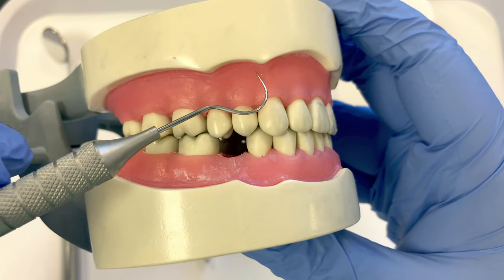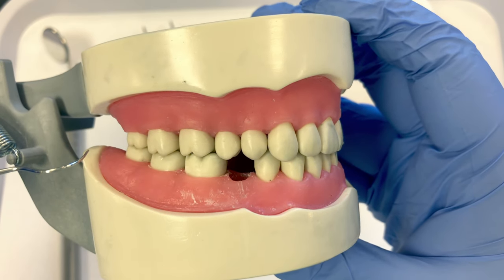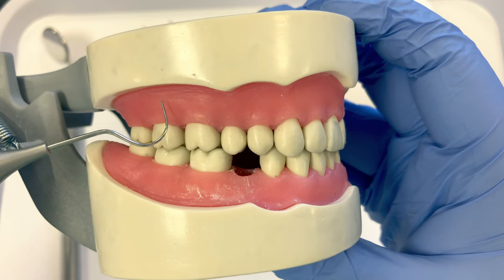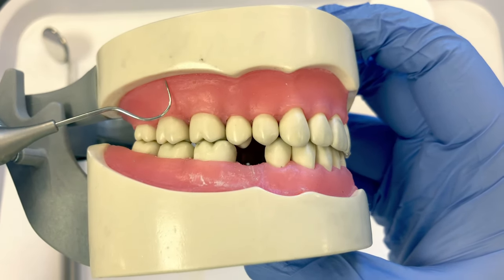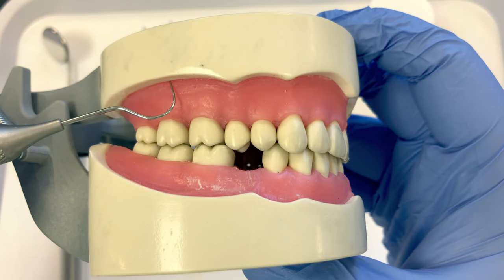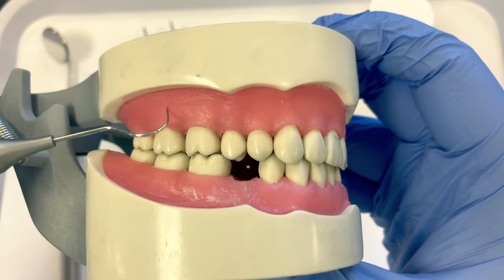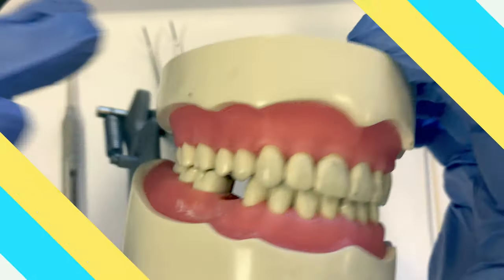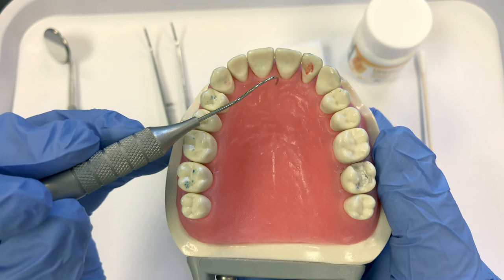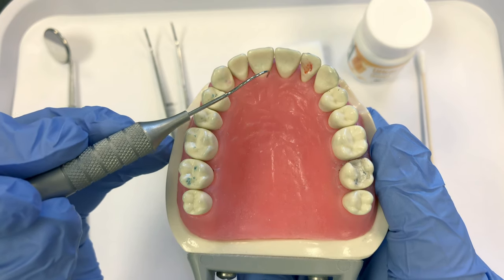This model can demonstrate the mucobuccal fold better because it has some soft tissue. If the doctor is working on tooth number two, a simple restorative procedure, you would place topical right where the pink meets the tan area on the mannequin — that represents the mucobuccal fold, where the cheek mucosa attaches to the attached gingiva. Looking at the palate, the nasopalatine block occurs right at the incisive papilla, a little raised area directly lingual to those two central incisors.